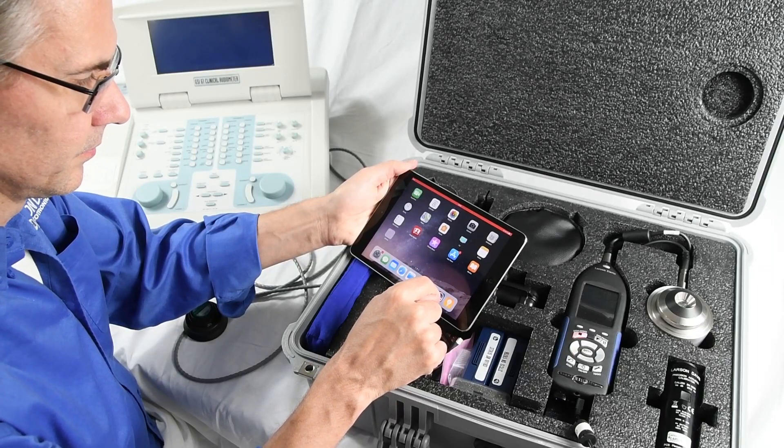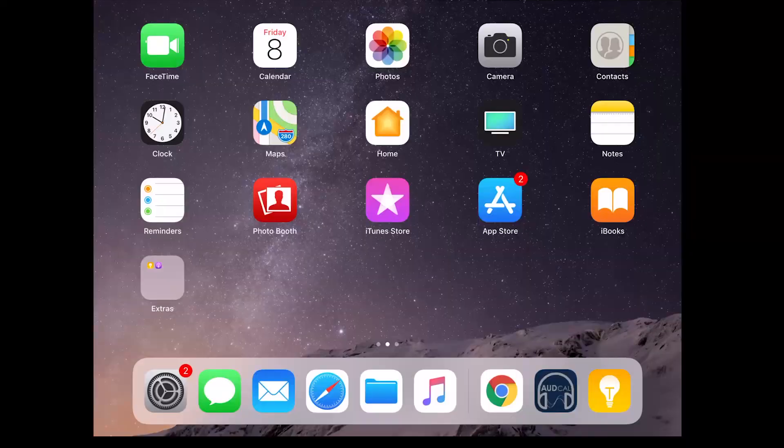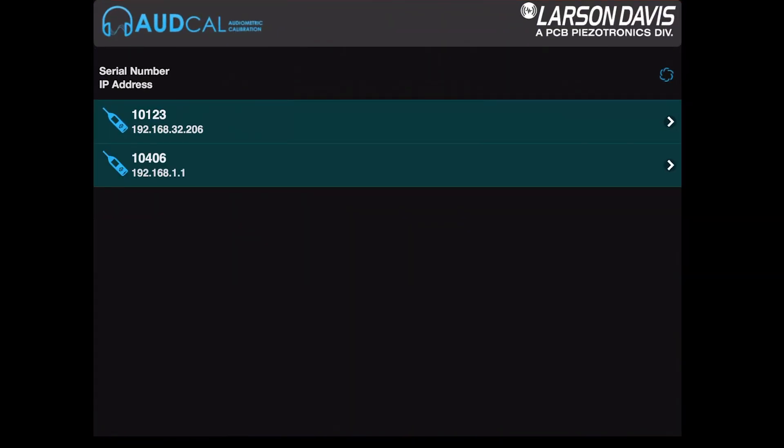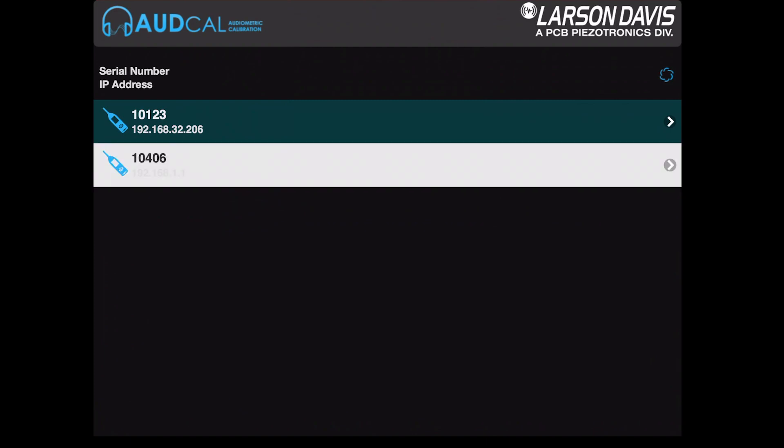Once connected, open up the Larson Davis AudCal app. When you open the app, select your meter.